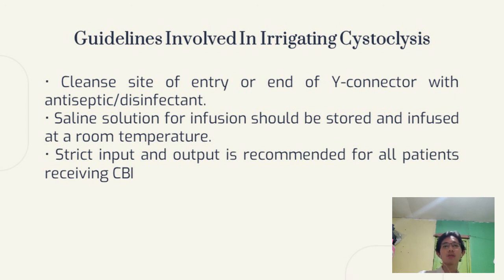Next, the saline solution for infusion should be stored and infused at room temperature. Normal saline solutions could be irritating to the delicate tissues inside the urethra and bladder, especially if there is already some trauma due to the insertion and presence of the catheter, so whatever solution is used should be warm to the body temperature, because cold solution can cause spasms that are very uncomfortable to the patient.